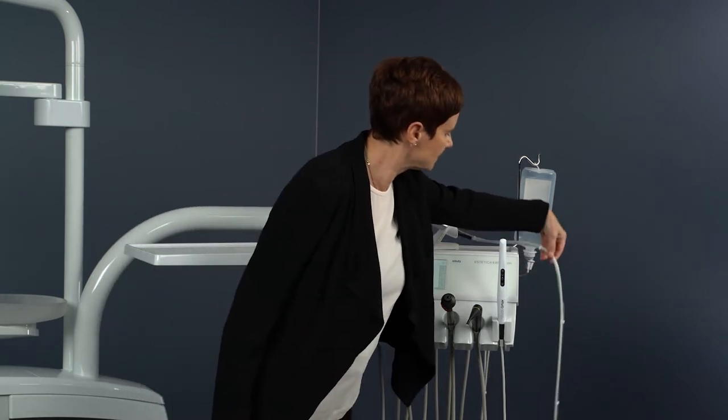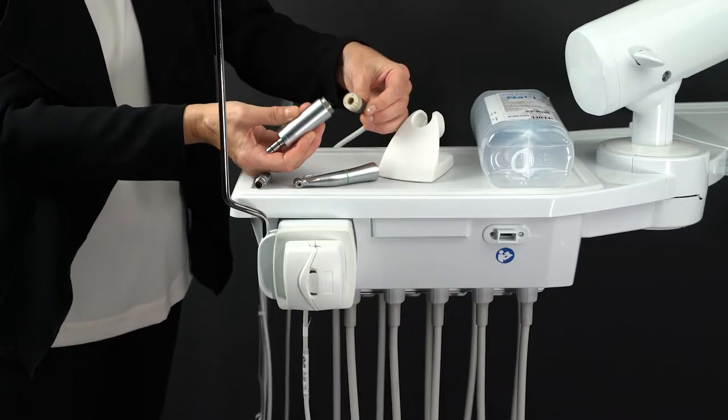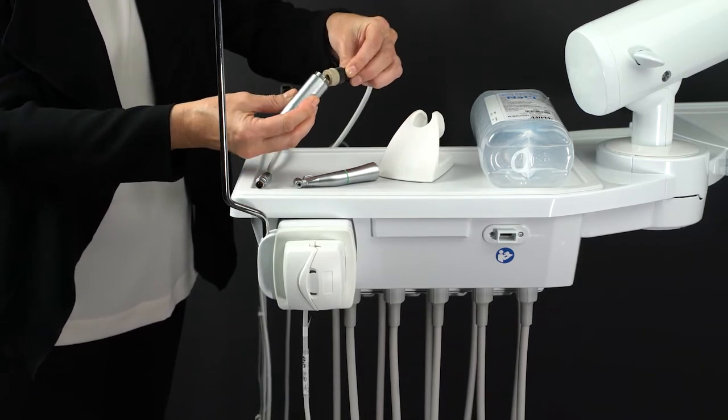The surgical motor must be connected to the surgical connection on the dentist element in order to be able to use the function. To do this, plug the surgical motor onto the motor coupling and secure it with the union nut.